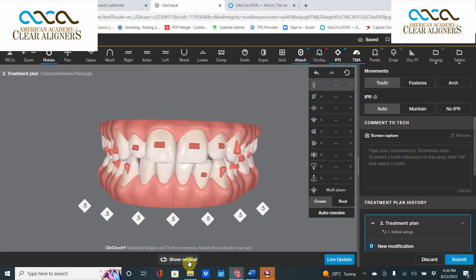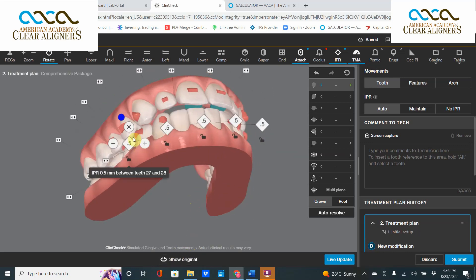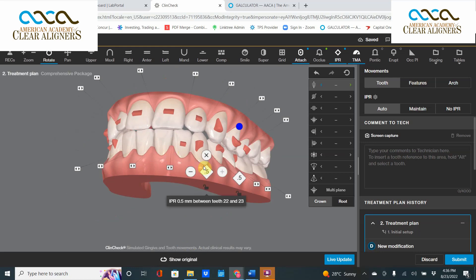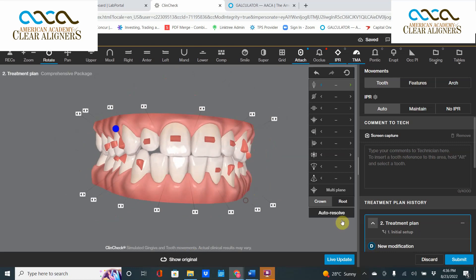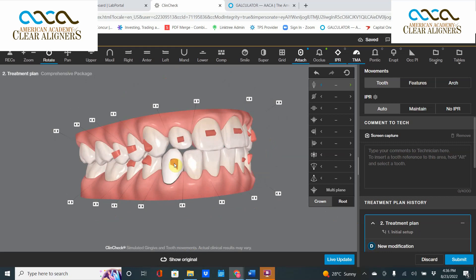This is the before and after. Now I'm straightening the top teeth, moving out the canines, and all that — but now I can get rid of almost all of this lower anterior IPR. It's not needed. If you don't extrude the top teeth down and close the envelope of function, you're not going to need all this IPR. Let's see where it comes out — I'll do auto resolve to get it to the final spot. I can do this entire case without IPR.